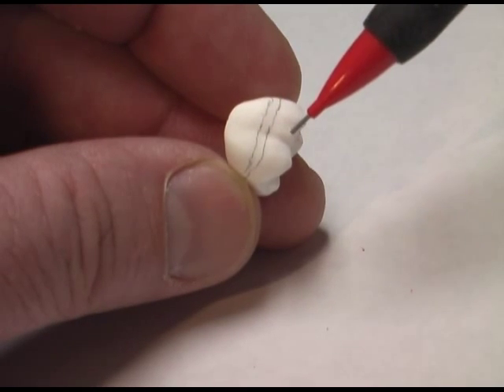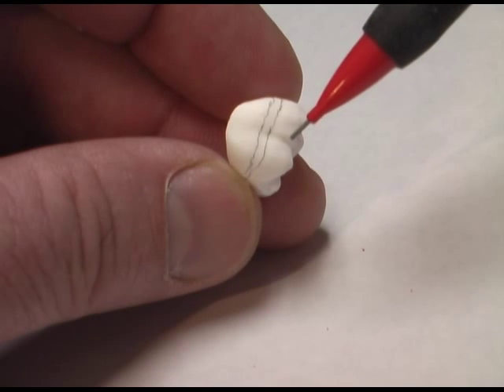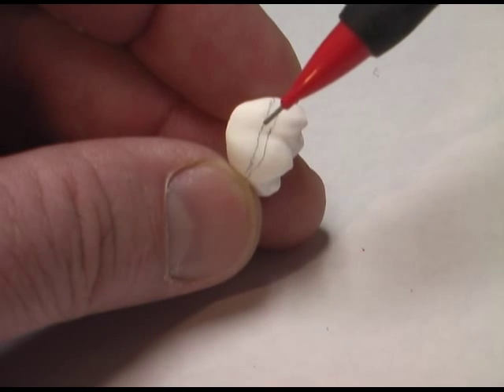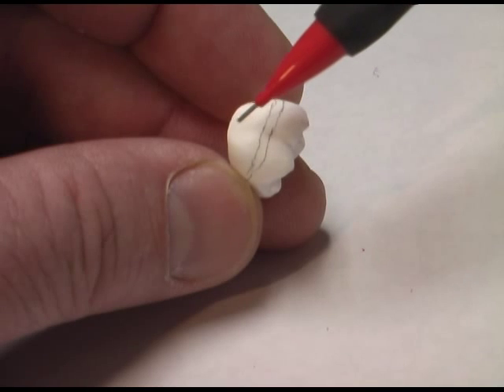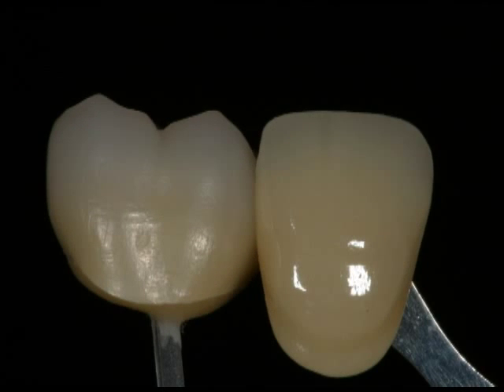Five coats of enamel in the incisal area above the highest line. And in the transition zone, we'll end up with five coats — three of which are enamel and two of which are dentin. This will help us create a nice smooth visual transition from dentin to enamel without any harsh lines.